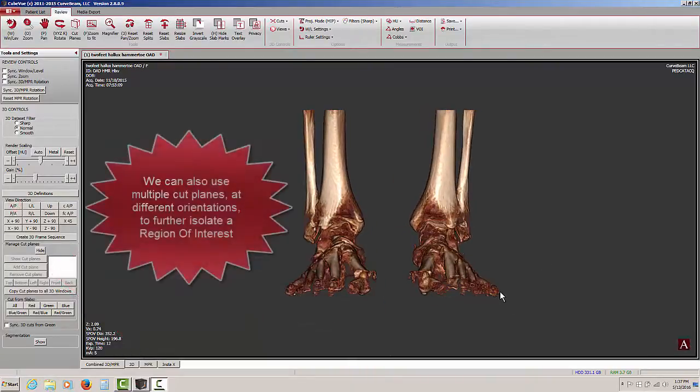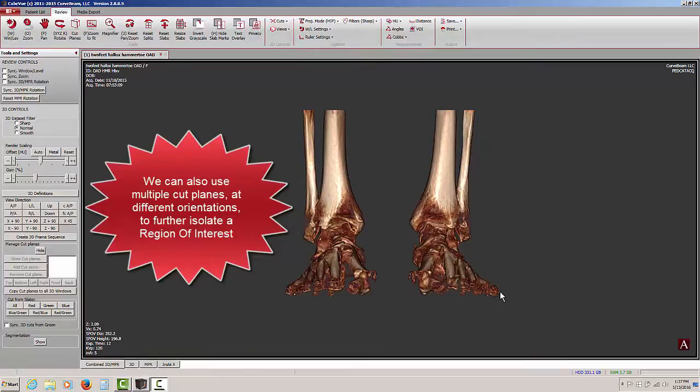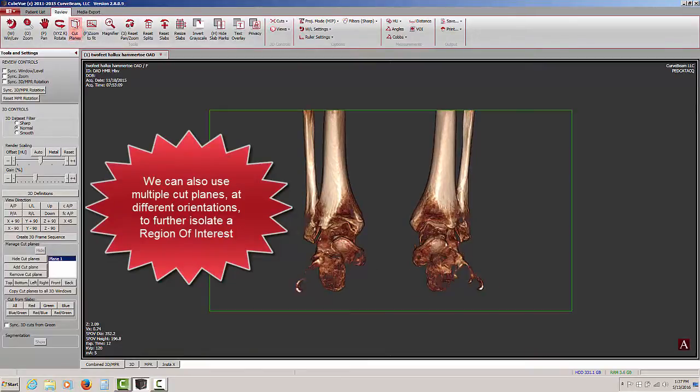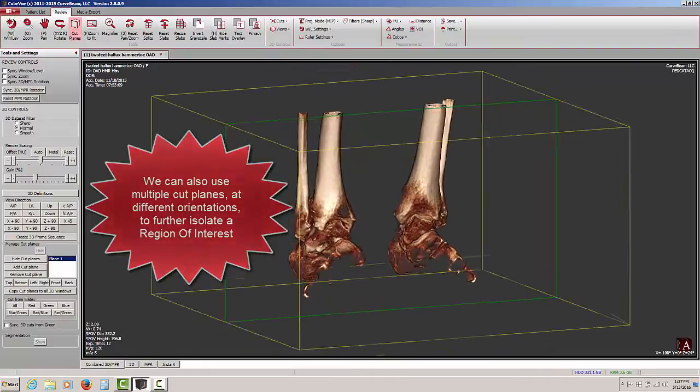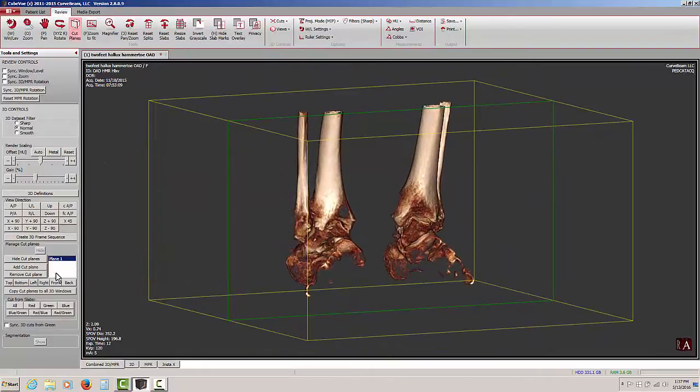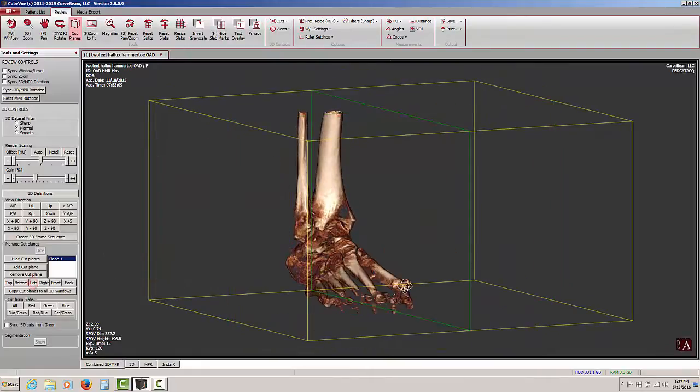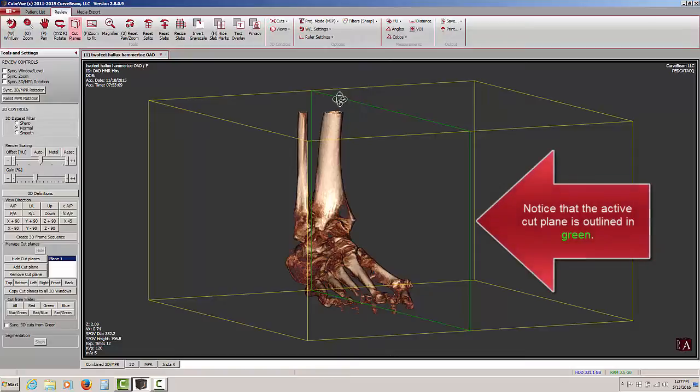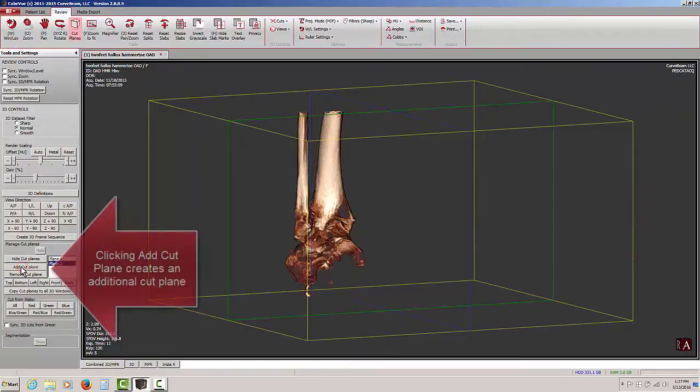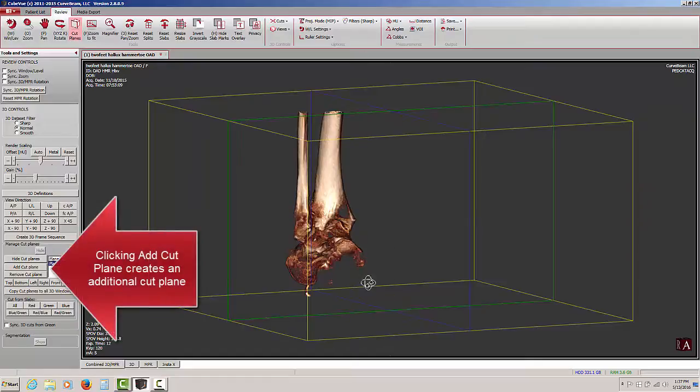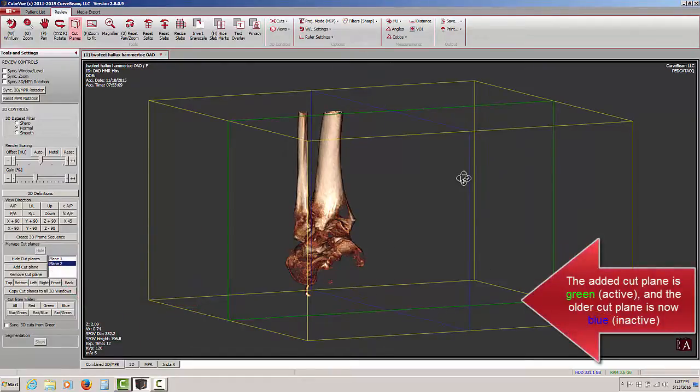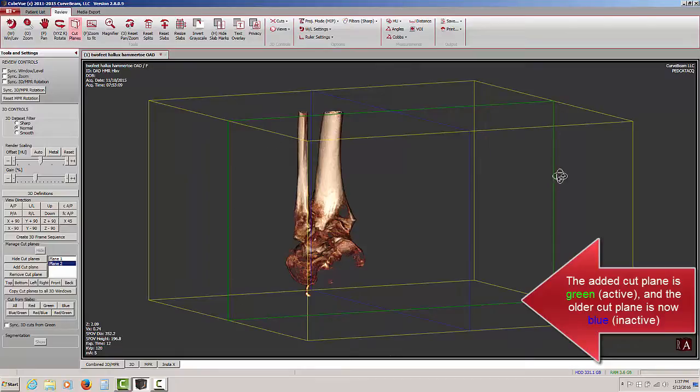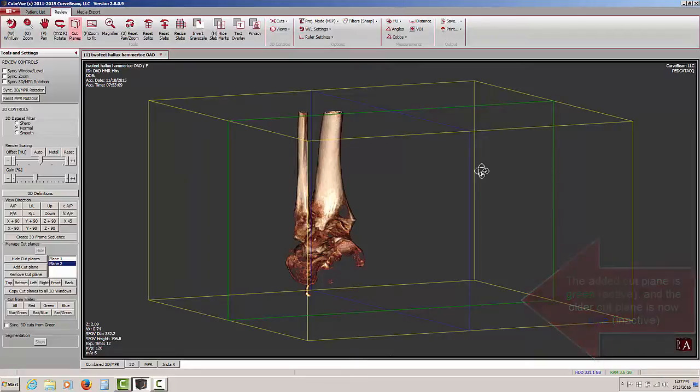We can also use multiple cut planes to further isolate our region of interest. I'm going to activate my cut planes here, then I'm going to switch again to isolate a single foot. Notice that my active cut plane is outlined in green. When I add a second cut plane, my first cut plane is now outlined in blue. That means that it is inactive, and any work I do will be restricted to the green cut plane. The green cut plane is always the active cut plane.